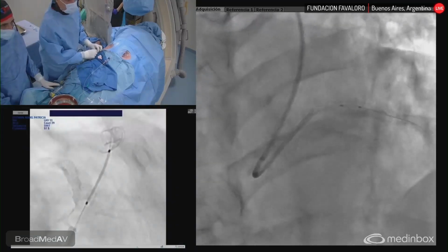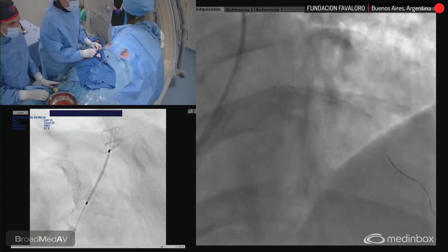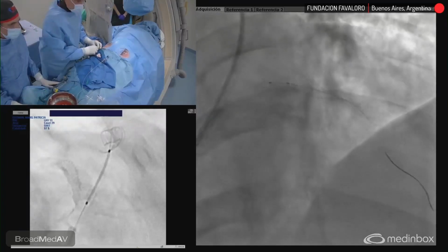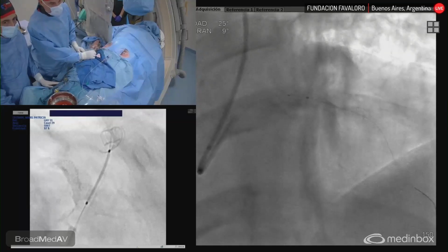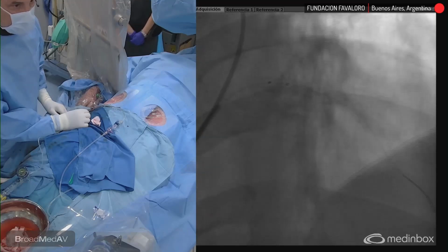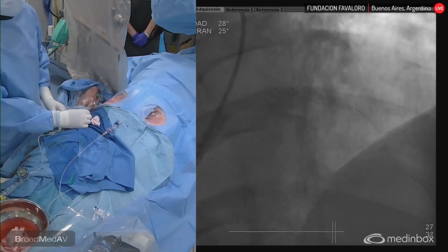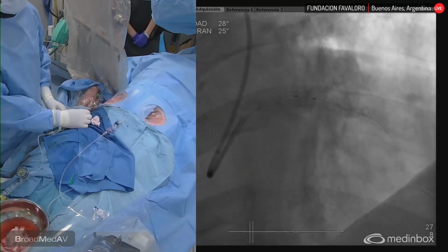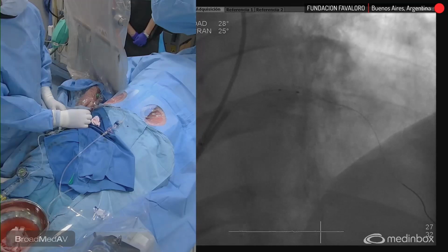Yeah, that's what I was talking about here. It is much easier to understand where Dr. Lev can observe some under expansion, exactly there on the curve. Anyway, the area is 8.2, so it's a very good result. Yeah, absolutely. I think that we can leave it like this.